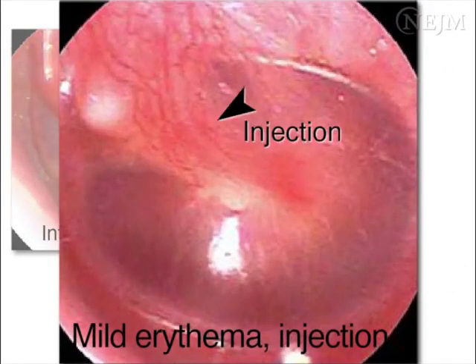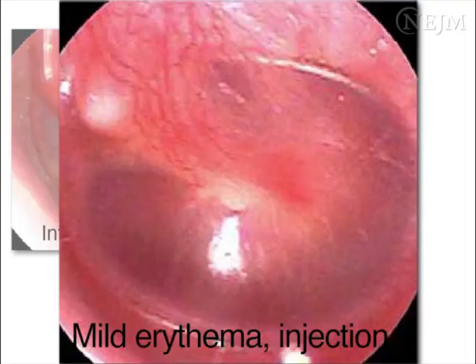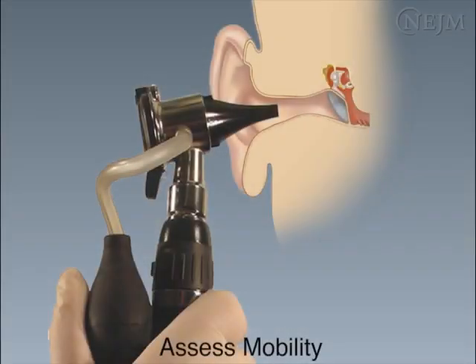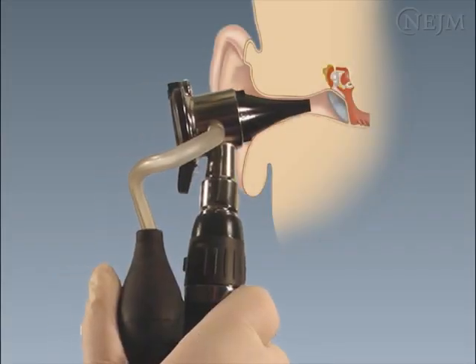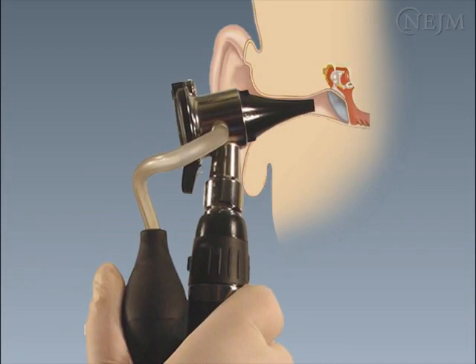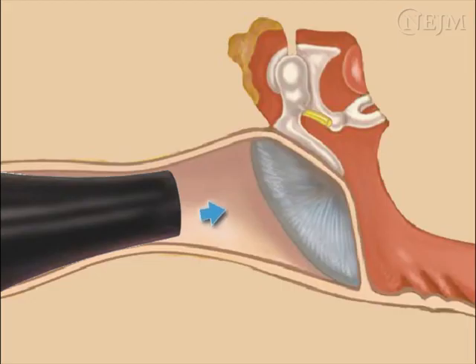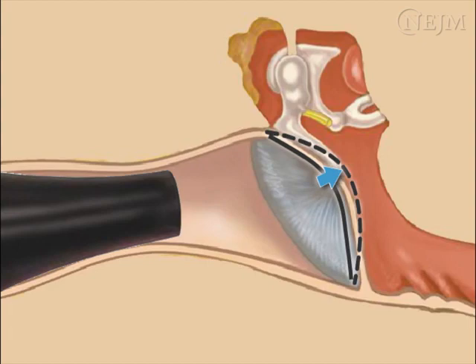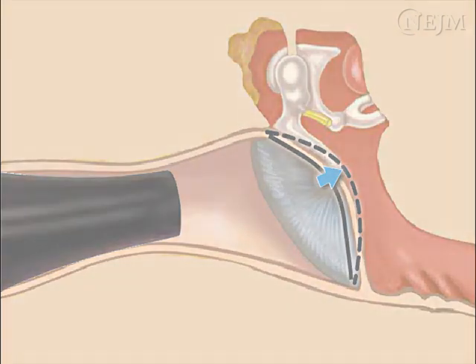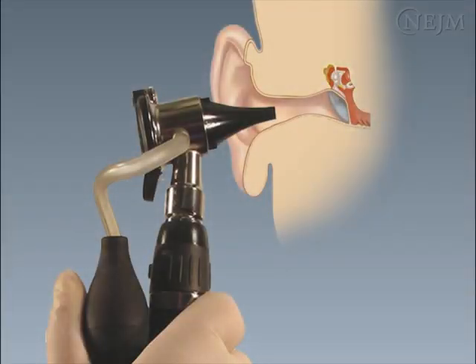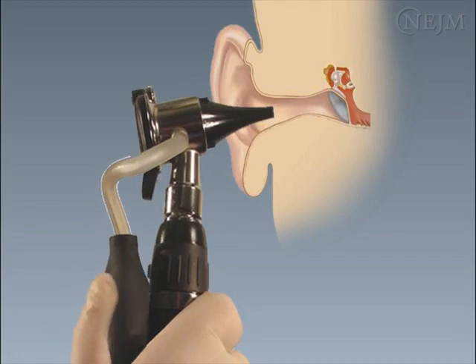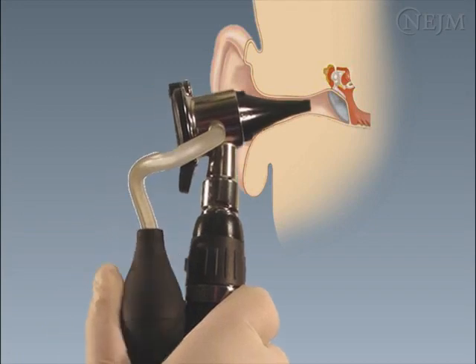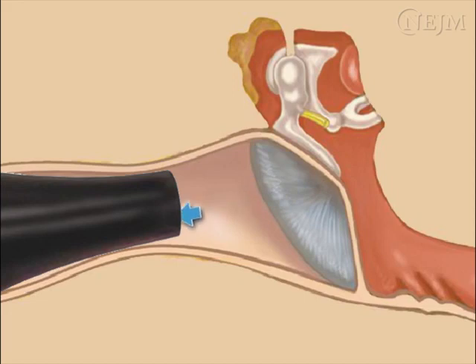Mild erythema and injection of the tympanic membrane are nonspecific findings and often occur if the child is crying during the examination. To create positive pressure, insert the pneumatic otoscope without placing any pressure on the bulb, then depress the bulb gently and observe the degree of movement of the tympanic membrane away from you. To create negative pressure, insert the otoscope with the bulb partially depressed, release the bulb, and observe the degree of movement of the tympanic membrane towards you.